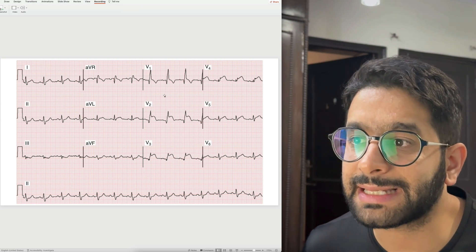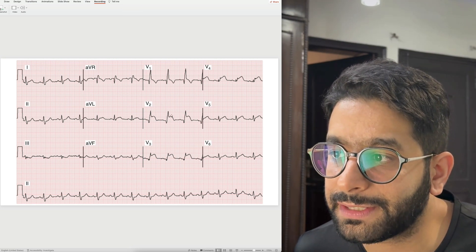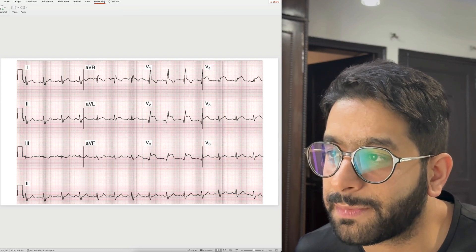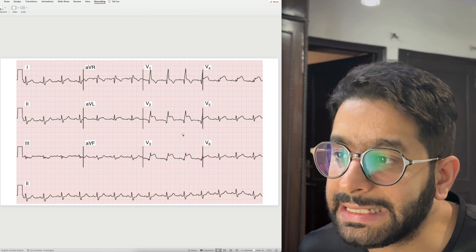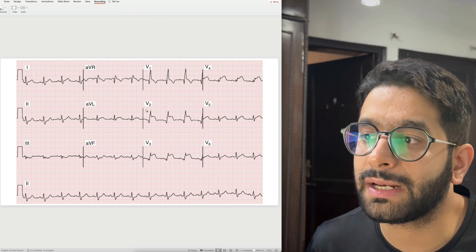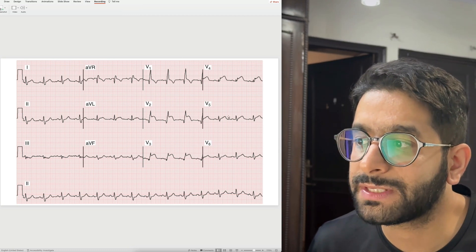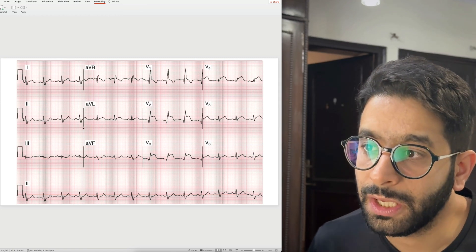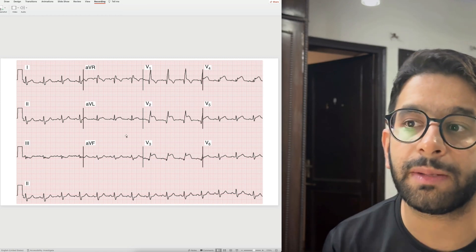In the next ECG, you again see the ST segment elevated above the baseline — elevated, elevated, elevated above the baseline again. This is a case of anterior wall myocardial infarction because the ST segment elevations are in the anterior precordial leads V1 to V4, with some subtle elevation in V5 also. So this is a case of anterior wall ST elevation MI.